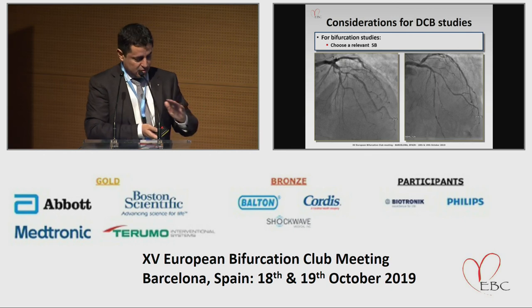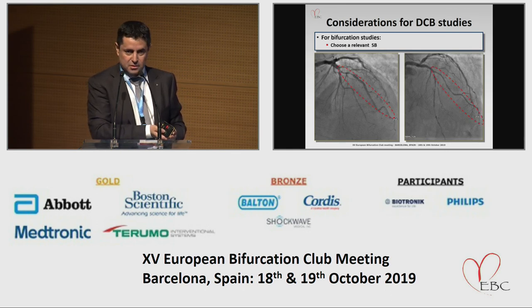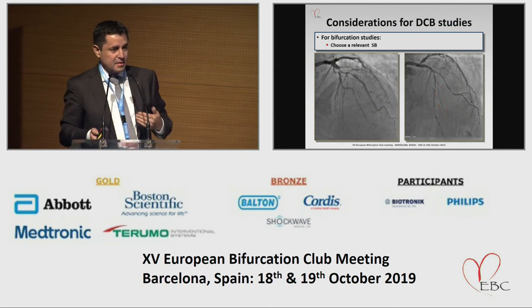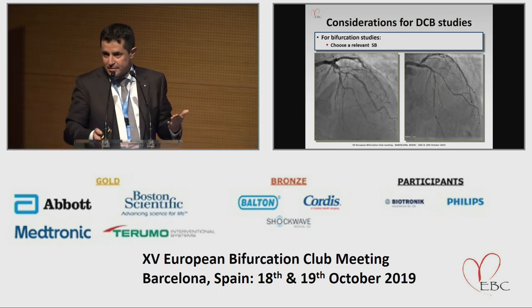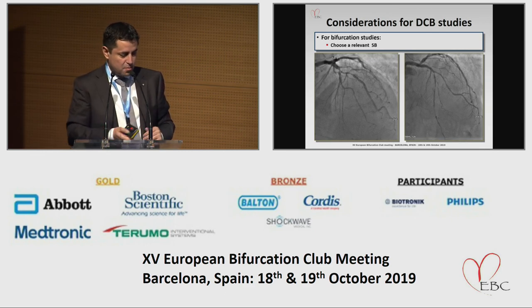And finally, I think this is the one you will all agree with: we have to choose a relevant side branch. If we plan our study for these side branches, but our investigators enroll these side branches, then we will have ruined our study. If we have an irrelevant side branch, this will have no impact on your study, irrespective of whether your technique or your device is good or bad.